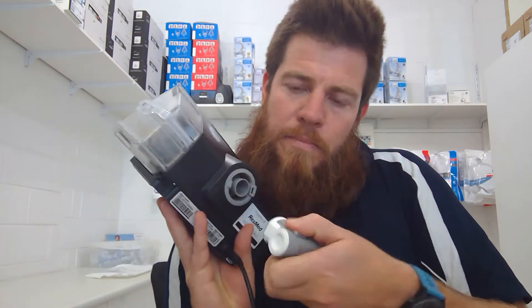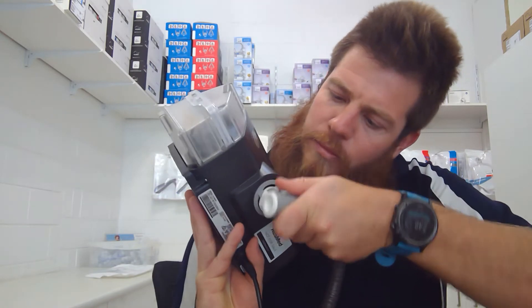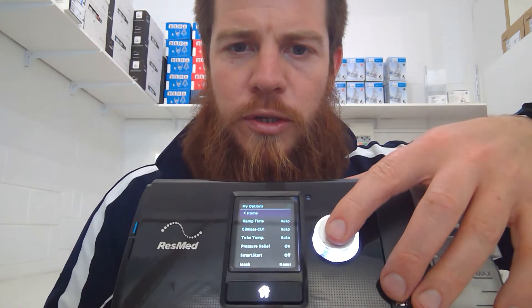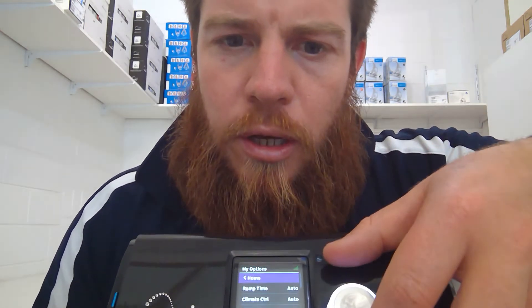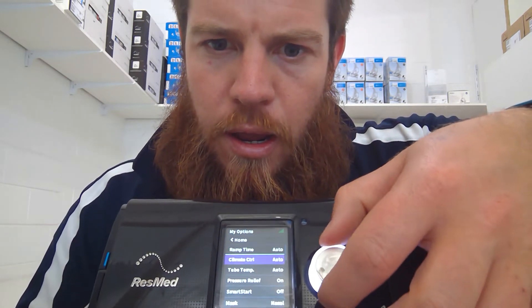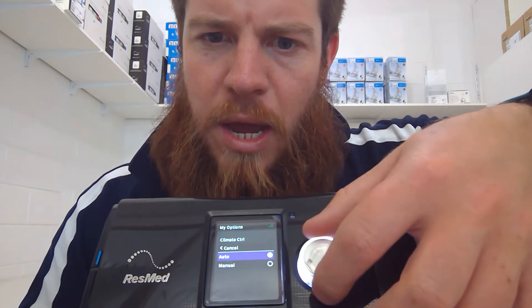With the AirSense 10, it's going to be a bit tricky doing it on camera. To change the humidifier settings, I recommend having your heated tube clicked in — just plonk that into the back of the machine. That allows us to change things a bit easier. Click into my options — this machine is currently set to auto, so you want to change that over to manual.